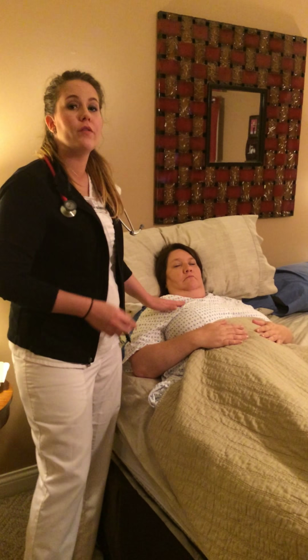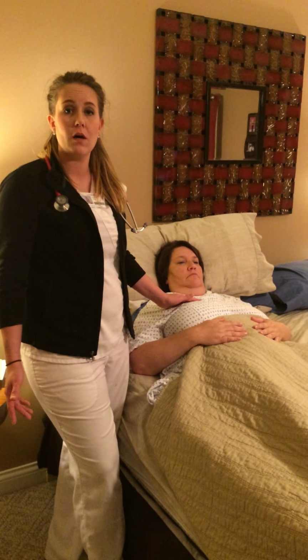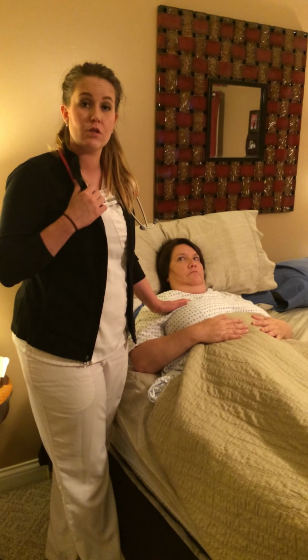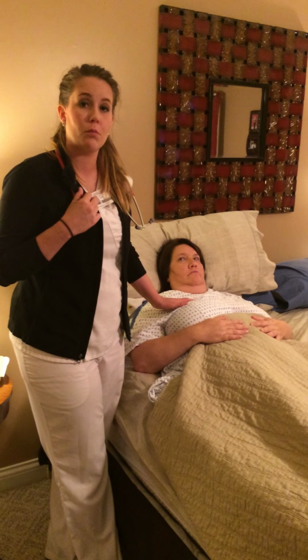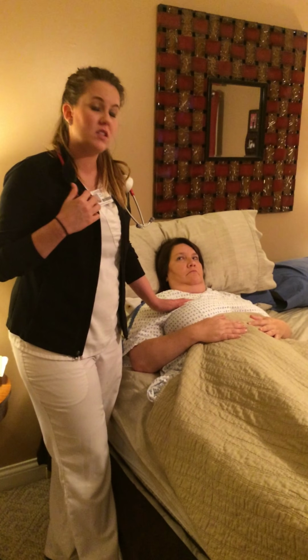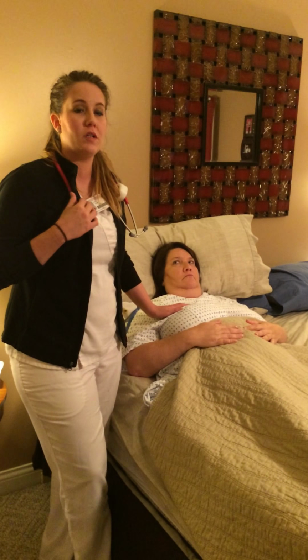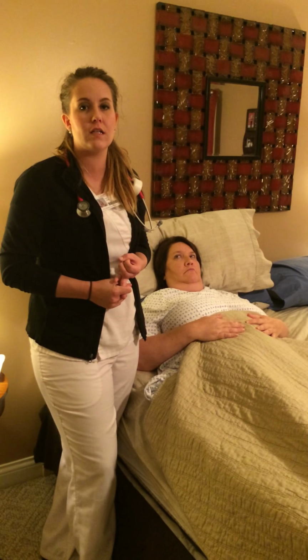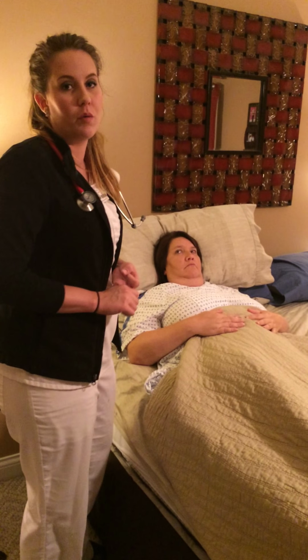When listening, like I previously stated, we want to listen for an S1, S2 sound, which is lub-dub. With the bell of our stethoscope, we listen for S3, S4 sounds, which are extra sounds. We listen for murmurs, and we listen for any extra sounds, and we note the timing of the S1, S2, the splitting of the S2, and those were all within normal limits.